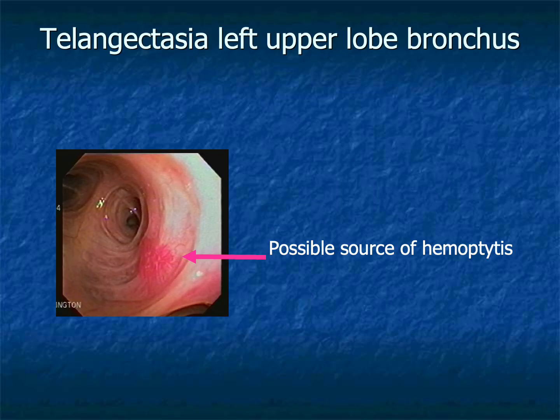Telangiectasias appear as small dilated superficial blood vessels within the bronchial mucosa. Although often incidental findings, they may occasionally represent a source of hemoptysis. Whenever evaluating a patient with airway bleeding, careful inspection for vascular abnormalities should be part of the examination.